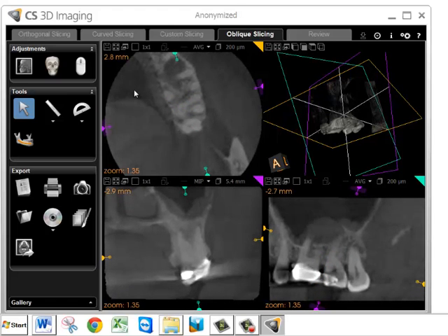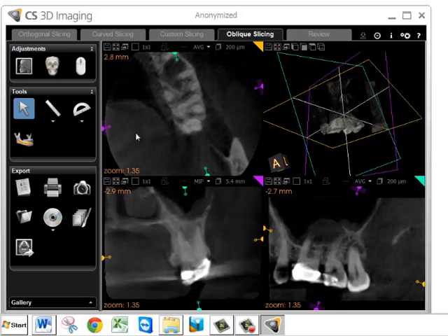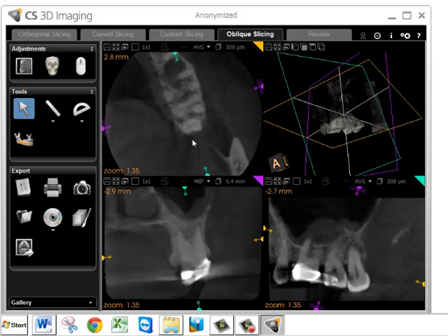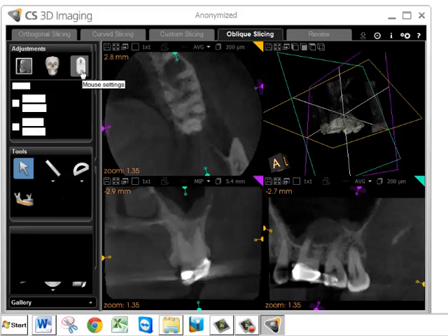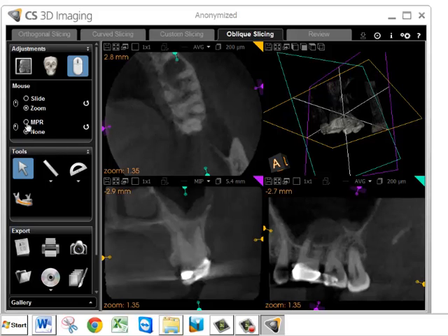Anywhere in any of the windows, if you hold the left mouse button and move the cursor up and down, it changes the brightness. Moving it right and left changes the contrast. Sometimes, darkening the brightness or increasing the contrast will make pathology more visible. If that doesn't work, click on the mouse settings window and be sure the MPR button is set. If it's set to none, that function won't work — it needs to be set to MPR.